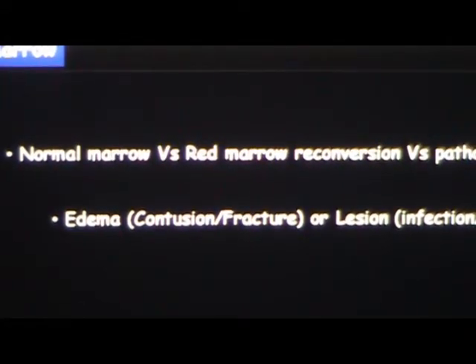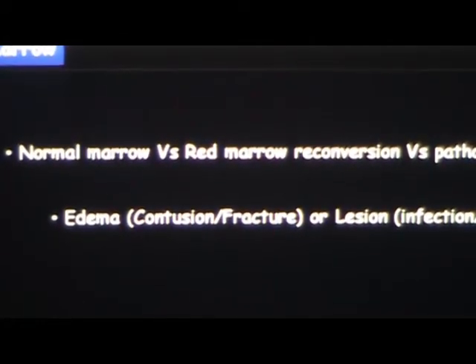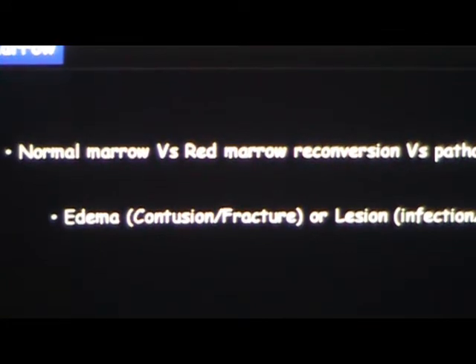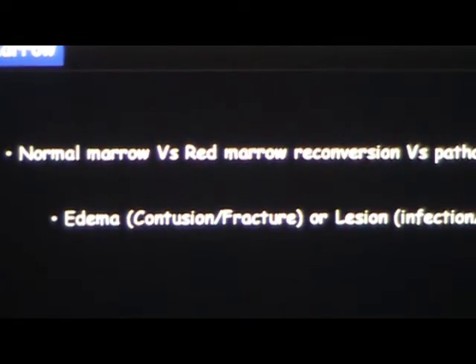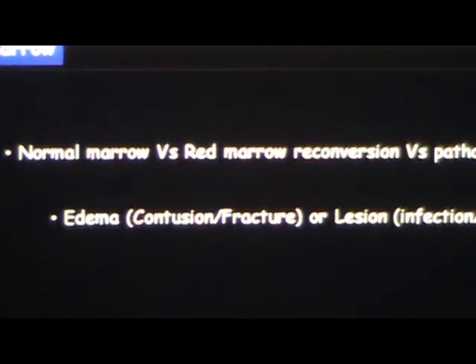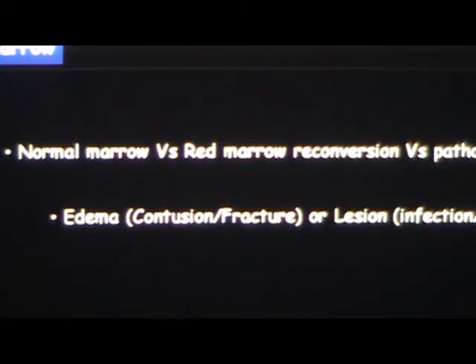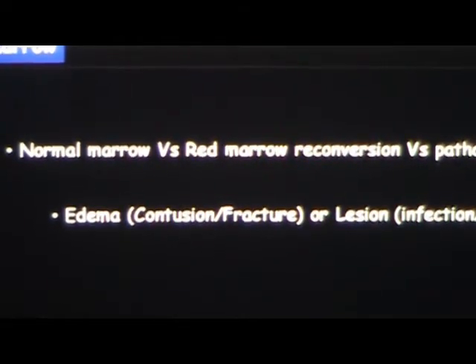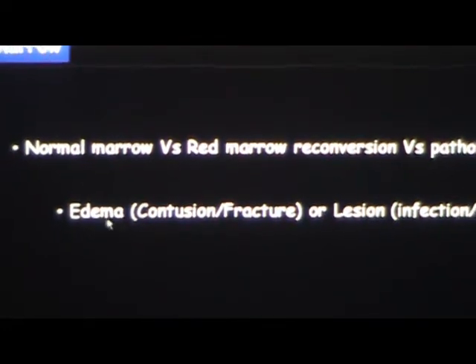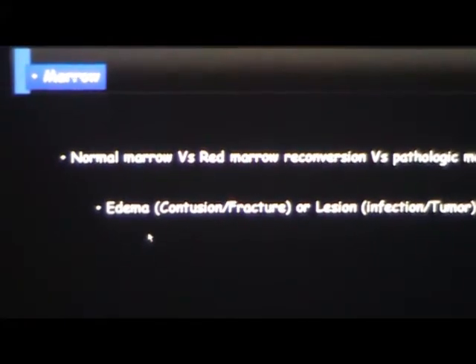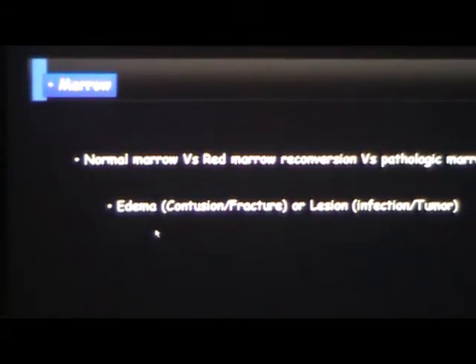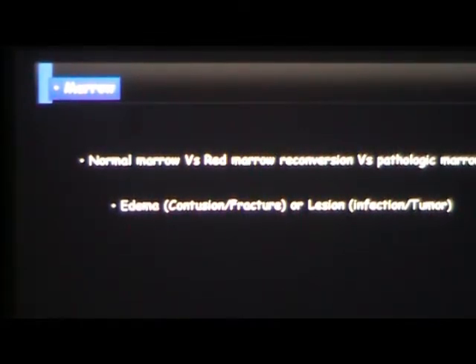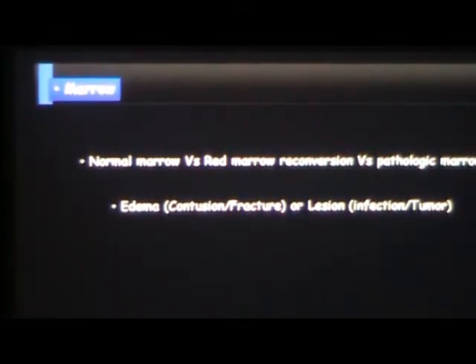When you look at marrow, first you have to decide: is it normal marrow? Is it abnormal marrow, or is it just a variation like red marrow reconversion? That's the first thing before you go into small structures — you may be missing a big fracture while looking for a small meniscal tear. When you see edema more on T2-weighted or fat-saturated images and less on non-fat-saturated images — disproportionate — think of more benign things.